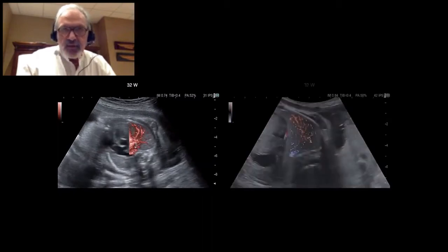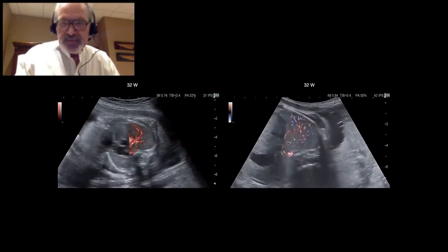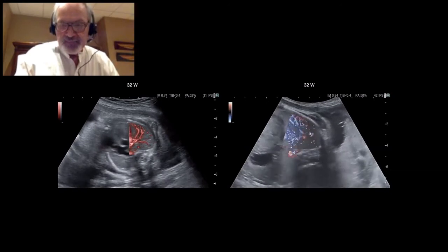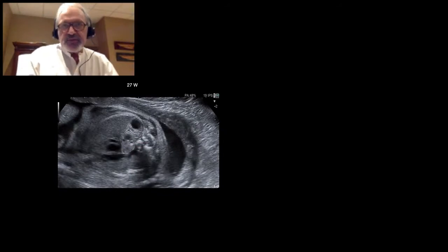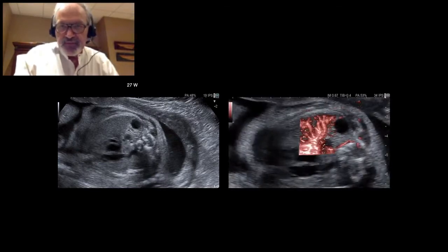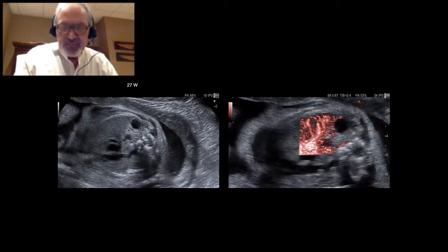Also, in the third trimester, depending on the setting, we can highlight the larger trunk or the small distal vessels, even while the fetus is making breathing movements, like you can see on the right. In this situation where there is a pulmonary malformation associating cyst and hyperechoic parenchyma, the DFI system shows a poor vascularization in the abnormal territory, as you can see here. So this is compatible with CPAM.